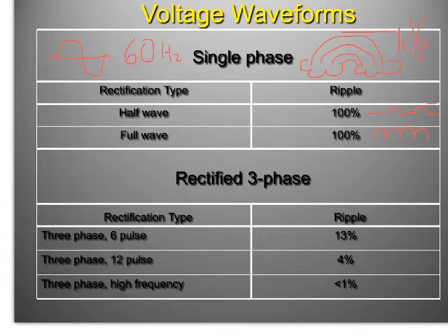So I've said I'm going to flip it over the line, and I'm going to say that's my pulsing there. But I'm also going to have 3 phases of this. So now I've got one that starts right here. And it's going to have the same spacing to it, but it's going to be slightly out of phase with the other one. And now I'm going to start another one right here. And it's going to be slightly out of phase again.